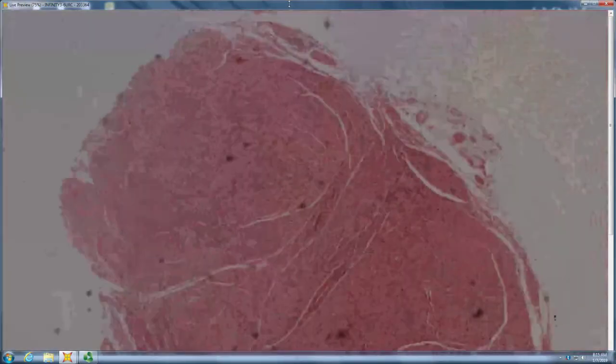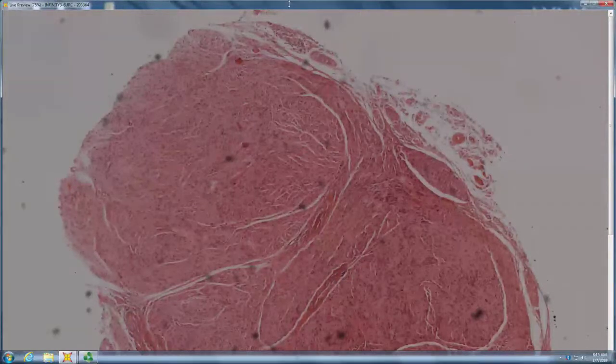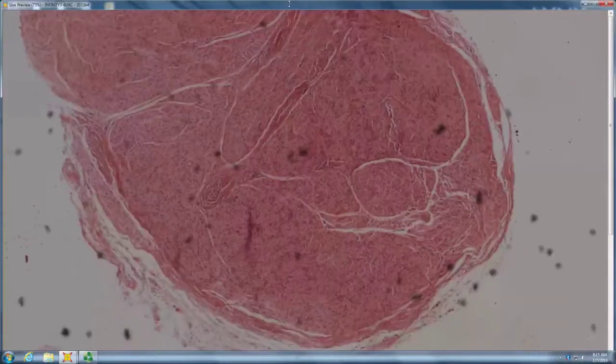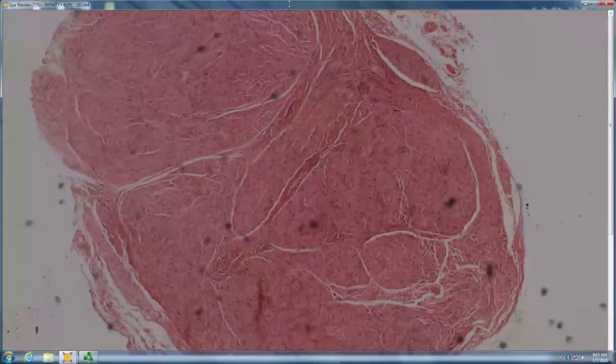What's that? A solitary nodule with clefts inside, maybe. This is PN, I think. Yeah, probably. PENs often shell out like that when you take them out.